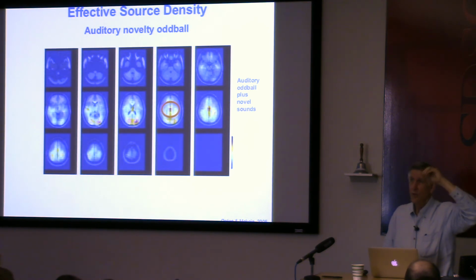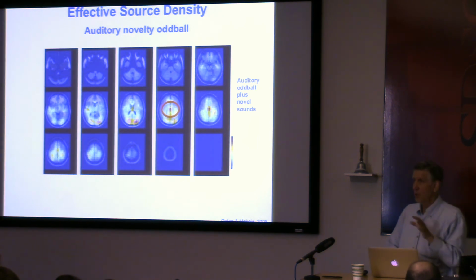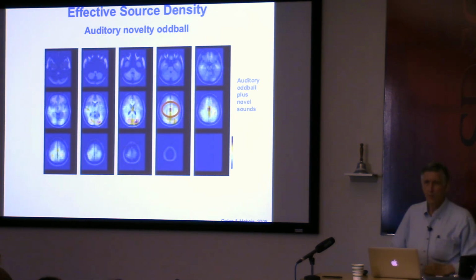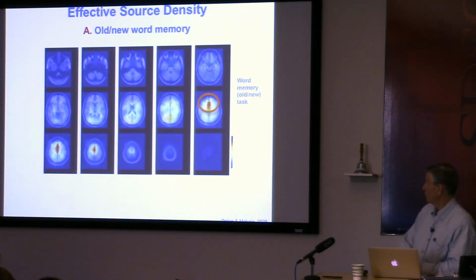So yes, there's very specific spatial information in EEG data, even interpreted with fairly careful but not exact co-registration with a head model. And not only that, these didn't all have 256 channels. Some of these had 70 or 128 or even 32. So there's a great deal of spatial information in your multi-channel EEG data that has typically been ignored in the analysis.